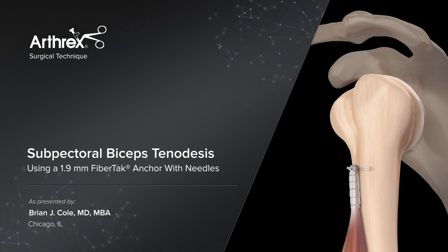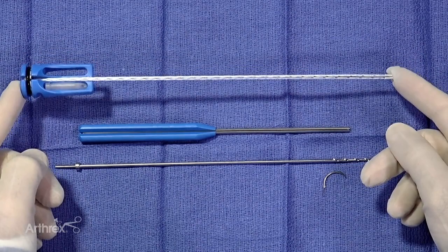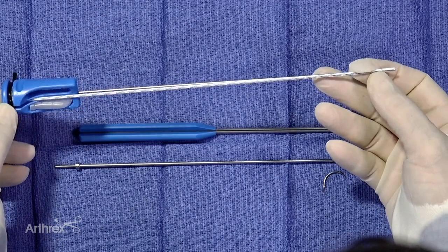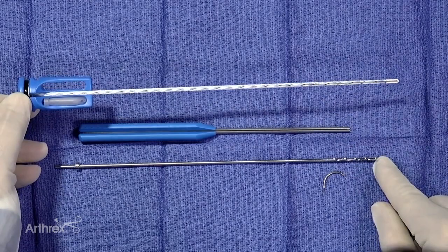What we're looking at here is the FiberTak biceps anchor, and what you'll notice are a couple of changes from the initial FiberTak. One is its working length is more appropriate for open procedures, but still could be used arthroscopically. It essentially has a sheath that will interface with the cortical bone and the near cortex. It's a very small 1.9 millimeter drill bit. It's 1.9 from the beginning to the end.